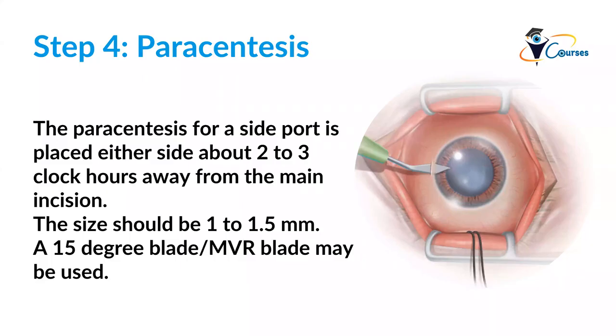Paracentesis can be done at the start or toward the end. It is a surgeon preference. Some surgeons even defer it to just at the onset of phacoemulsification, or just before phacoemulsification. So what are the paracenteses?